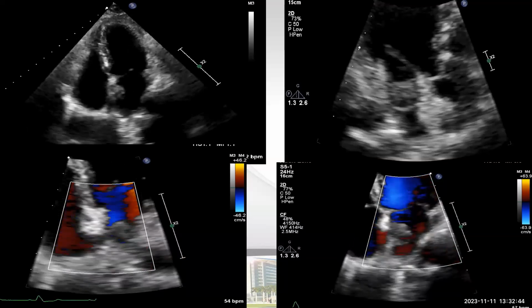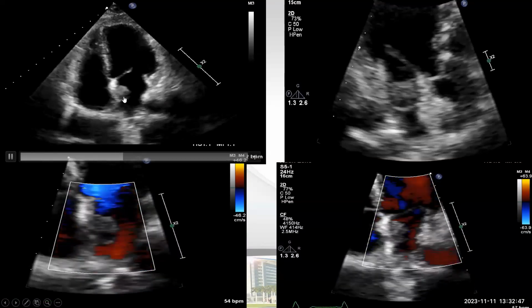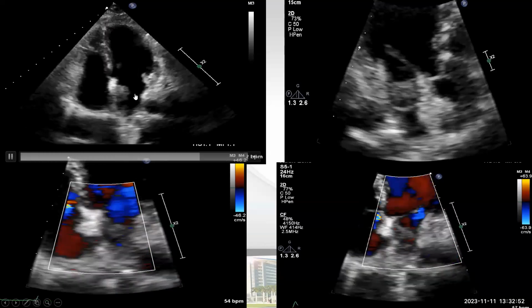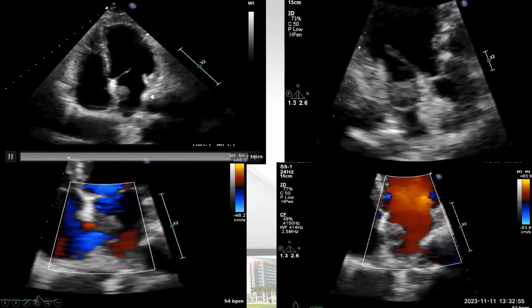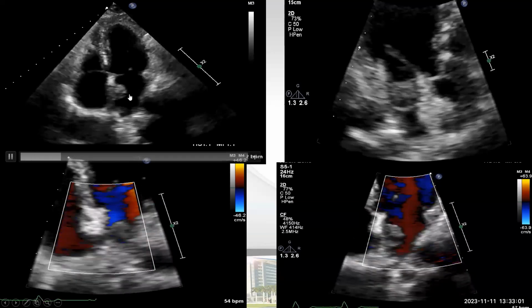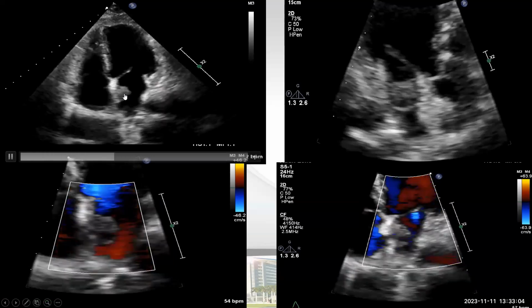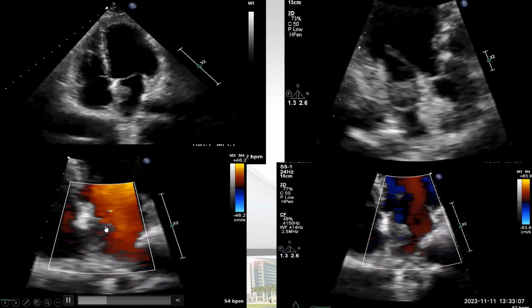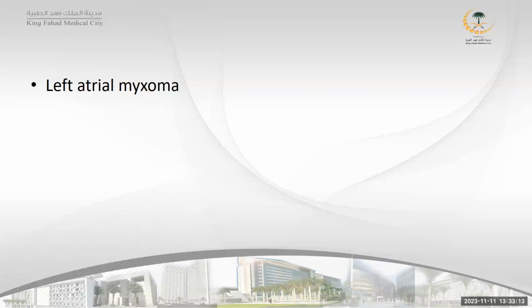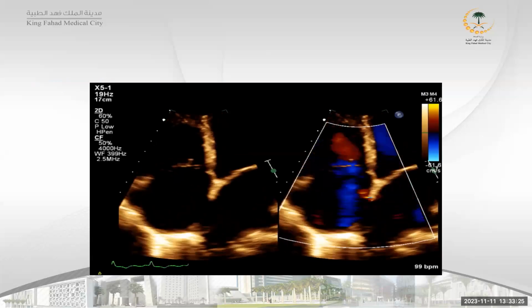Vegetation. So remember, if we bring you a left atrial mass, it could be thrombus, it could be myxoma. A thrombus usually will be attached mainly to the left atrial appendage or the roof, and it is usually more laminated, while the bulky masses are myxoma, usually pedunculated like here, hypervascular and attached to the septum. So this is left atrial myxoma. You can comment, that's right, that the LV was a bit dilated with RV dysfunction. However, the most important finding here is the myxoma. Okay, next.